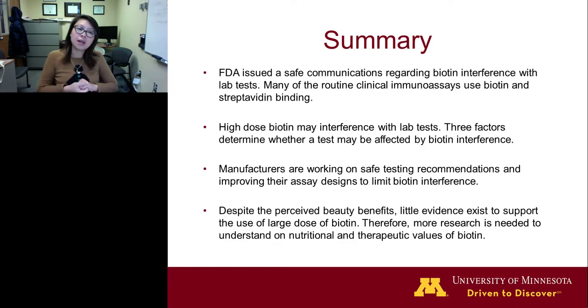With that, I'd like to summarize this webinar. I hope that I have demonstrated to you that biotin, when taken in very large doses, can interfere with many lab tests. There are three different factors that determine whether tests are actually affected by biotin interference or not. The manufacturers are working on safety testing recommendations to improve their assay design to limit biotin interference. And despite the perceived beauty benefits, we need to know more about the nutritional and therapeutic value of biotin supplementation.